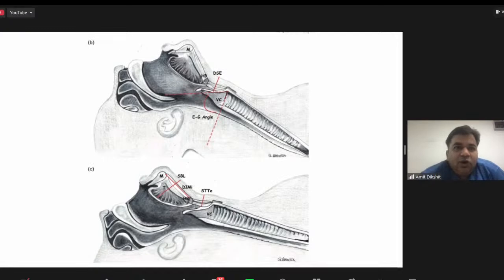And I think what ultrasound has done is we have started anticipating the airway in a better fashion, and therefore calling for help, getting all gadgets in place, making a backup plan, and it has reduced the anxiety for us, because most of the time there is a lot of adrenaline when it is a difficult airway. So till this stage, I think ultrasound has made some dent in reducing the anxiety, and the anticipation skill set is considered.